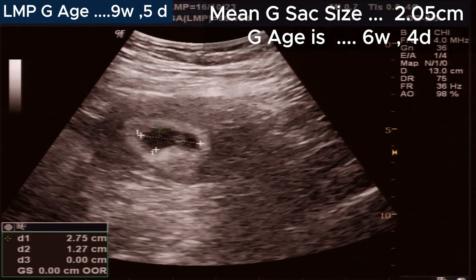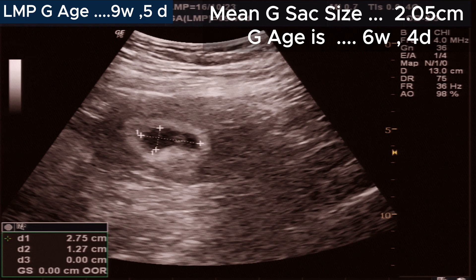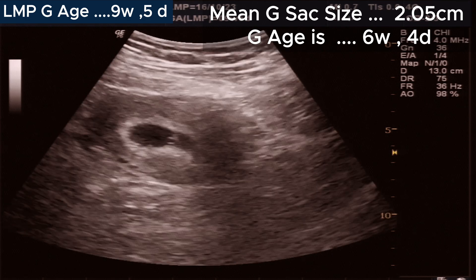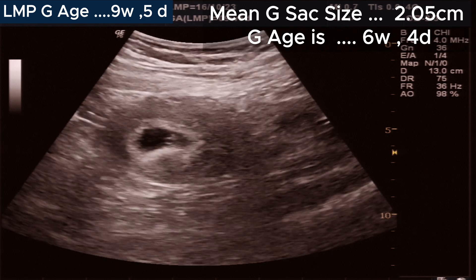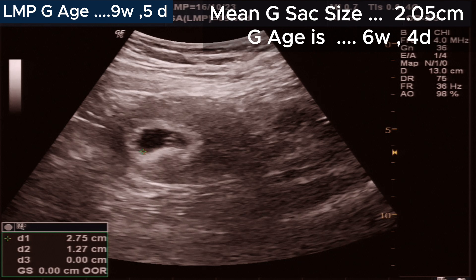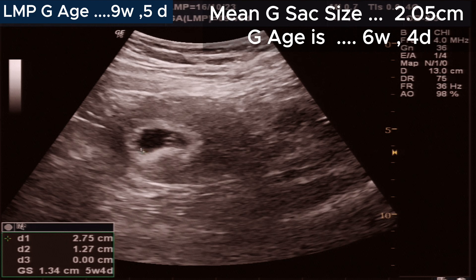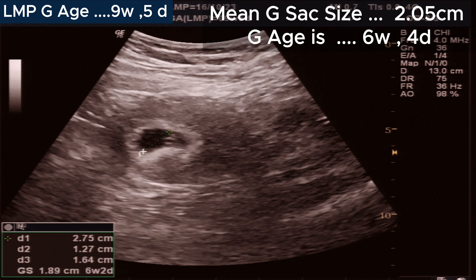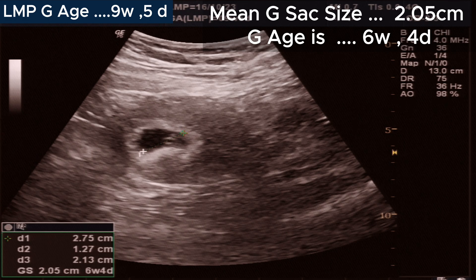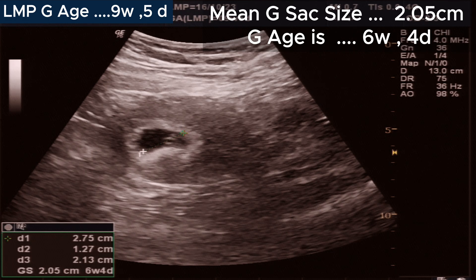The gestational sac margins are well-defined and smooth. The mean gestational sac size is 2.05 cm, corresponding to a gestational age of 6 weeks and 4 days.